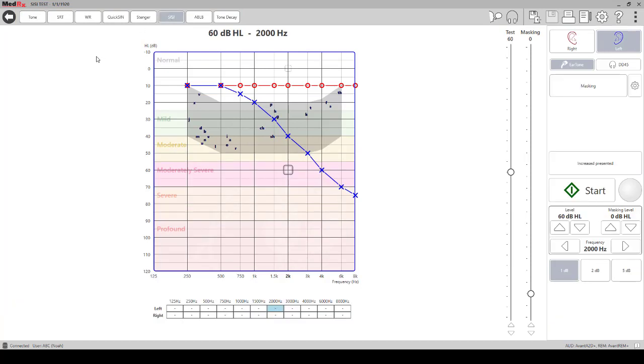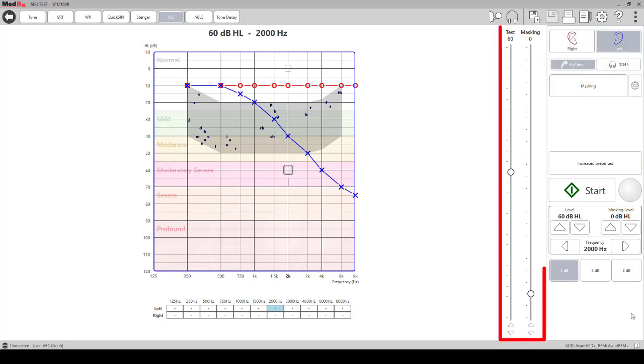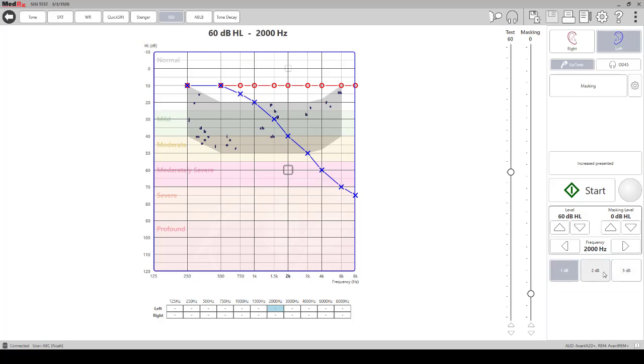You have your right and left ear options here, transducer options, your intensity for the tone that you're going to present, and you also have the decibel increase amounts that you want to use for this test. You have the options of using a 5 decibel increment, 2 decibels, or 1 decibel increment.